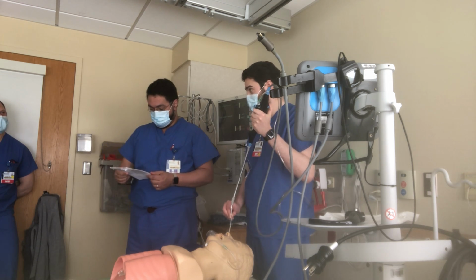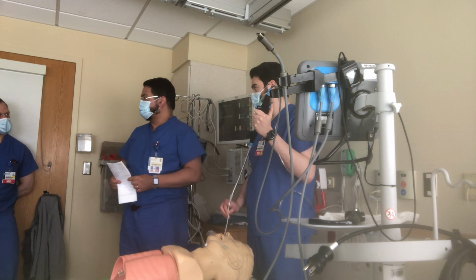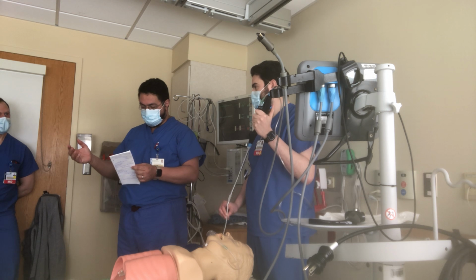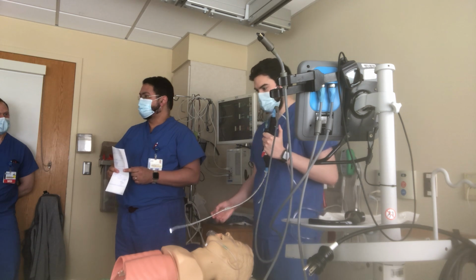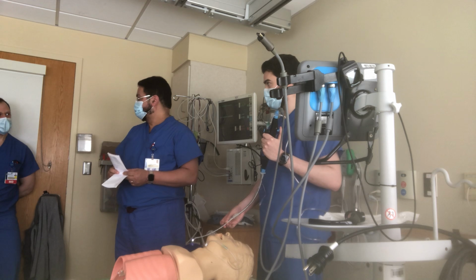Hook suction up to the... are we still using that scope or not? We have a different scope. No, we were just preparing. Is that gonna do the NG tube? So let me tell you, his saturation now is 85%. Suction on as much as we can from the lower pharynx and then try to intubate.